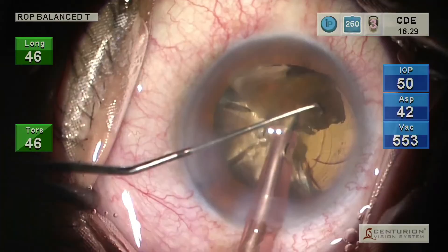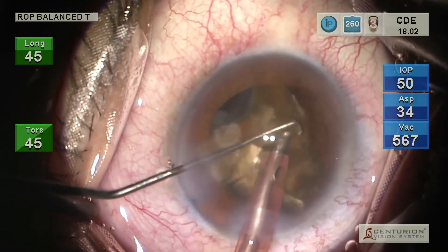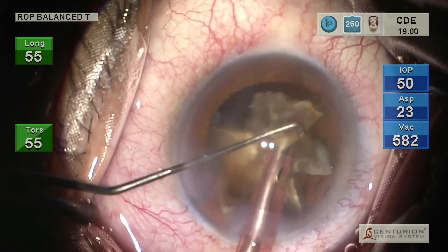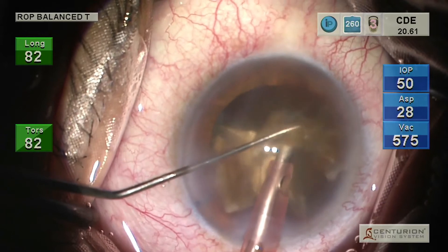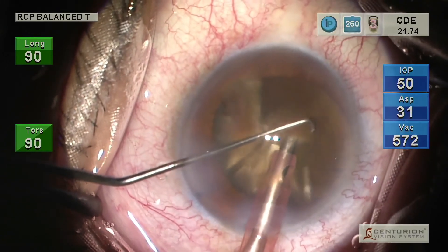While emulsifying the nuclear fragments, the foot switch is used in a controlled manner, and the chopper shaft, shaft-tip junction, and tip length shadow the nuclear fragments. The chopper shield ensures nuclear fragments do not bounce upwards and strike the endothelium despite any chatter.